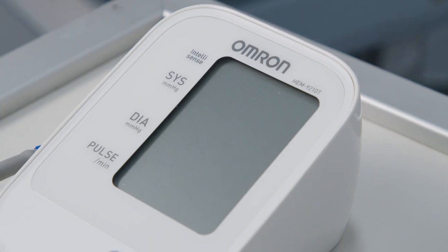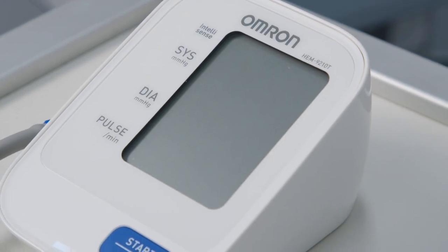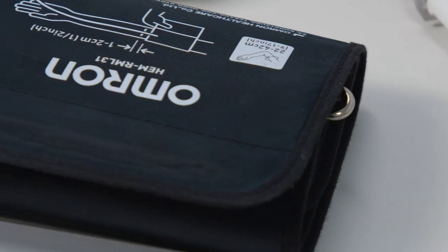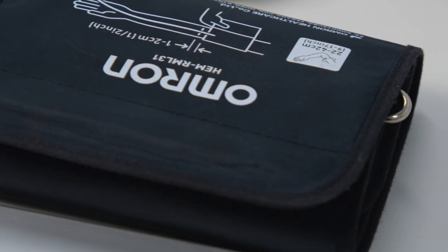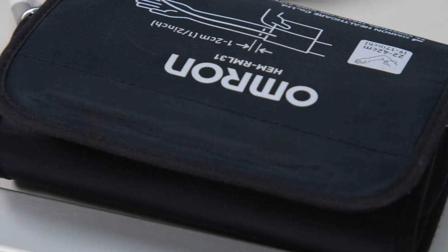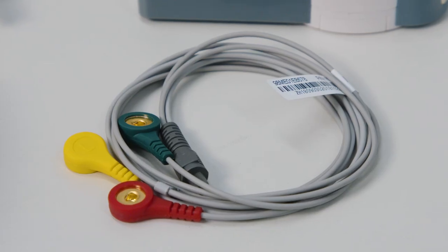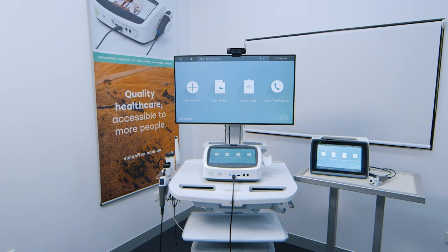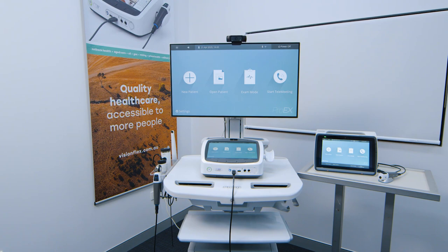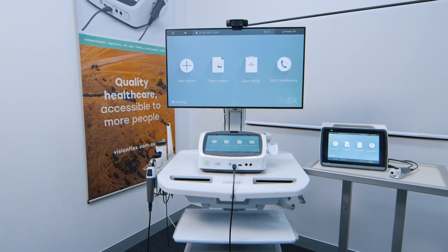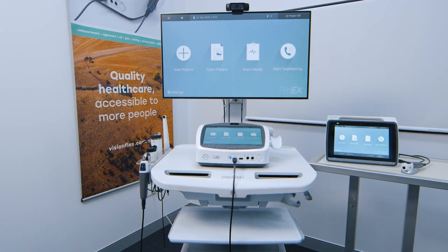To monitor blood pressure, there are three different cuff sizes for a variety of patients. Other accessories include a three-wire ECG, blood glucose monitor, spirometry, and ultrasound.